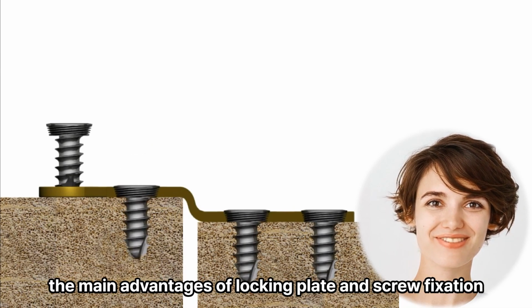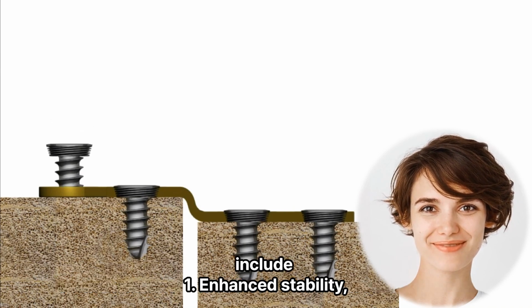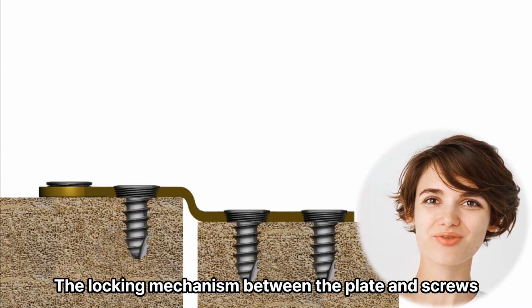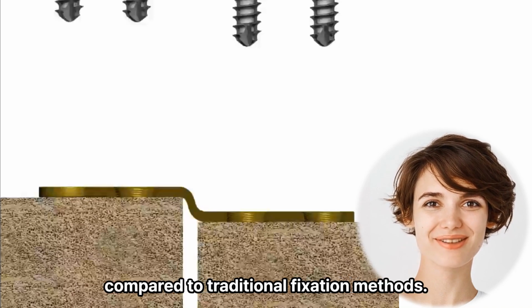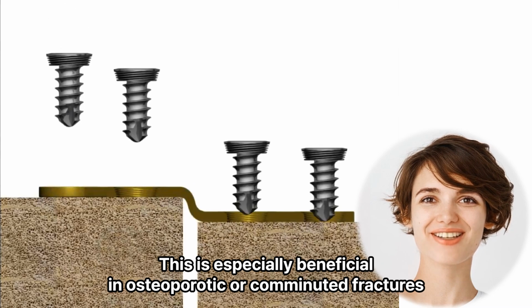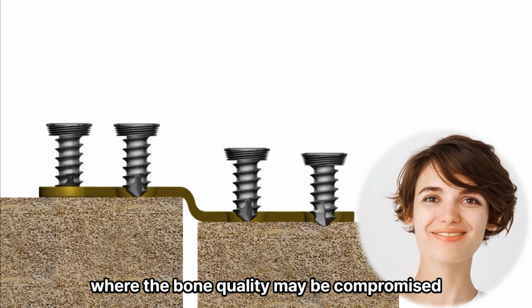The main advantages of locking plate and screw fixation include: 1. Enhanced stability. The locking mechanism between the plate and screws creates a fixed-angle construct, providing increased stability compared to traditional fixation methods. This is especially beneficial in osteoporotic or comminuted fractures where the bone quality may be compromised.